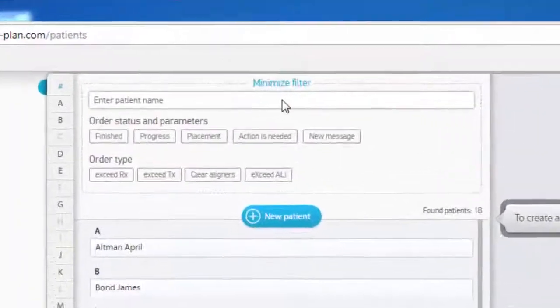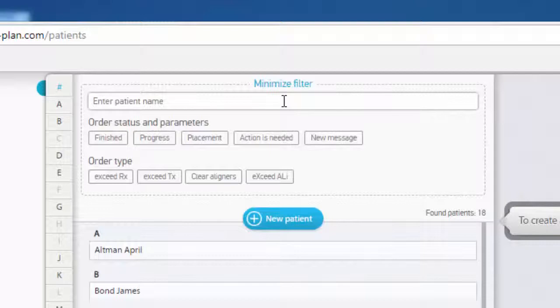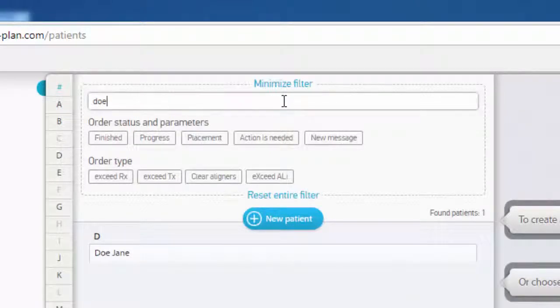To look for a particular order, use the predefined parameters or the search field.